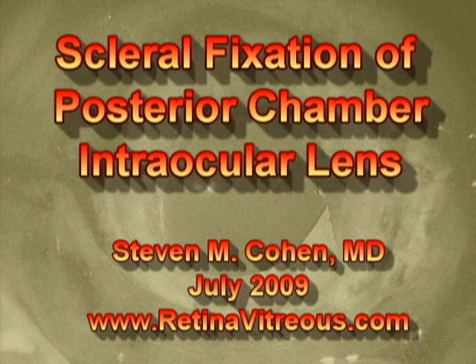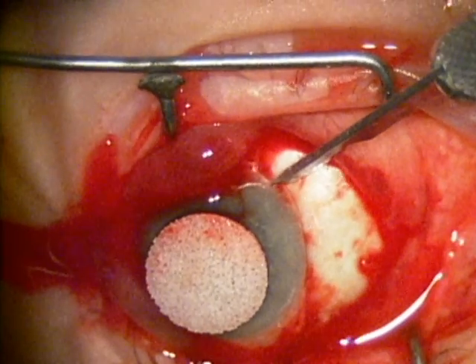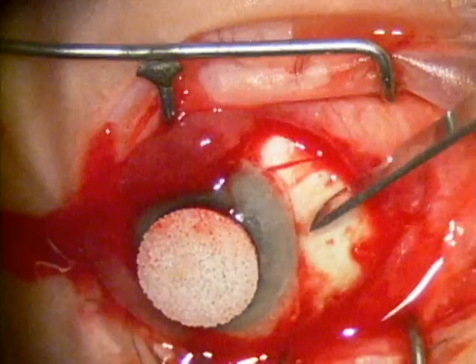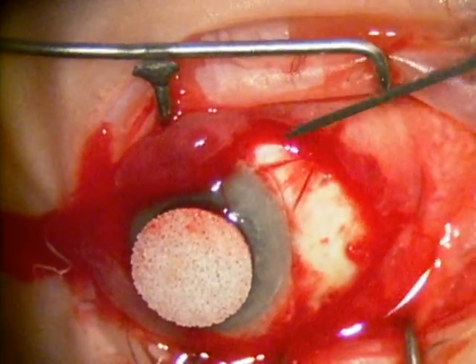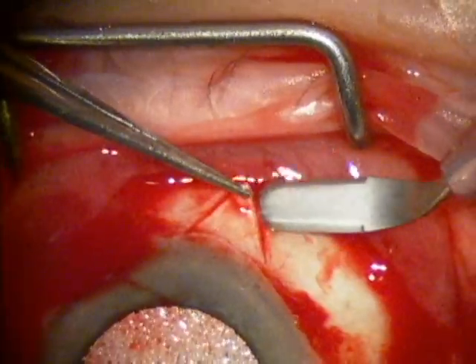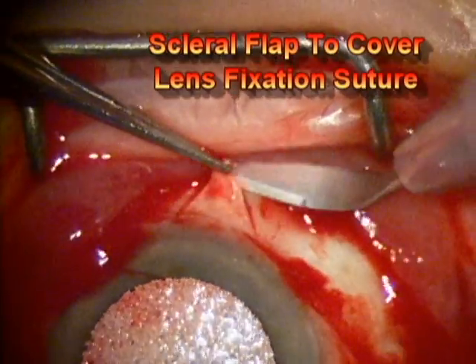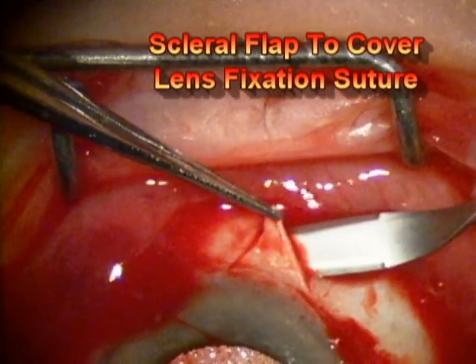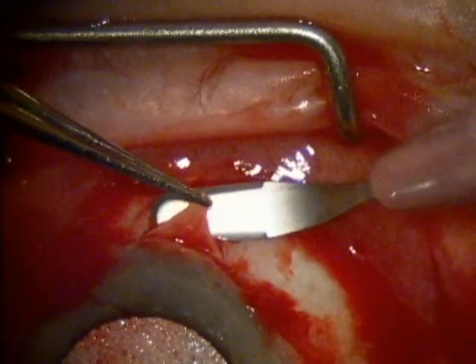Hello, this is Dr. Stephen Cohen and this video shows scleral fixation of a posterior chamber intraocular lens. At this juncture in the surgery, the surface of the eye has been opened and some cautery has been applied. Here you're seeing a triangular shaped scleral flap being dissected. This will be used to cover the trans-scleral suture which will be used to fixate the posterior chamber intraocular lens.